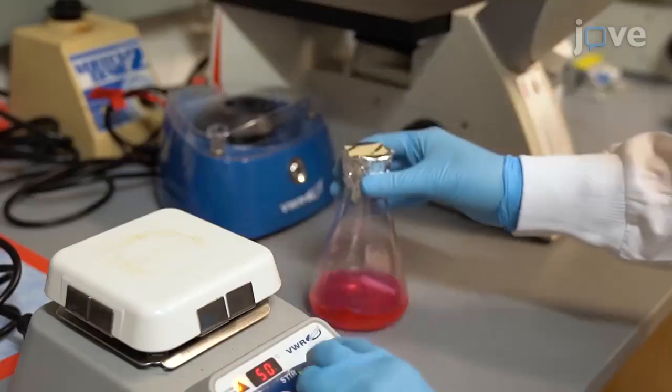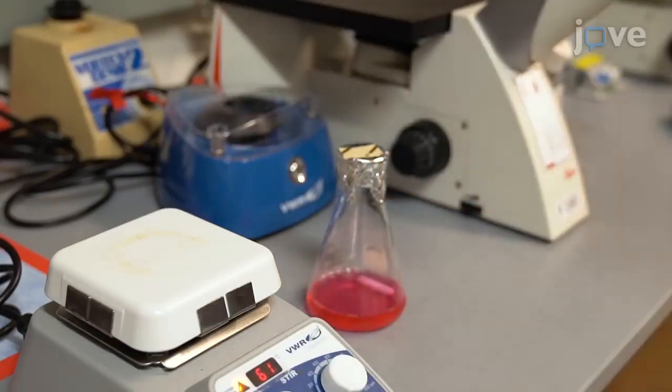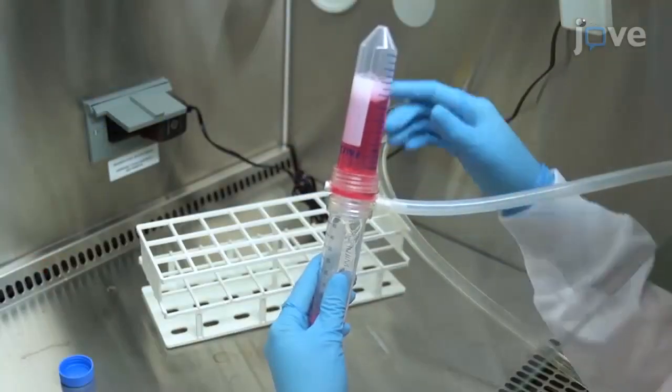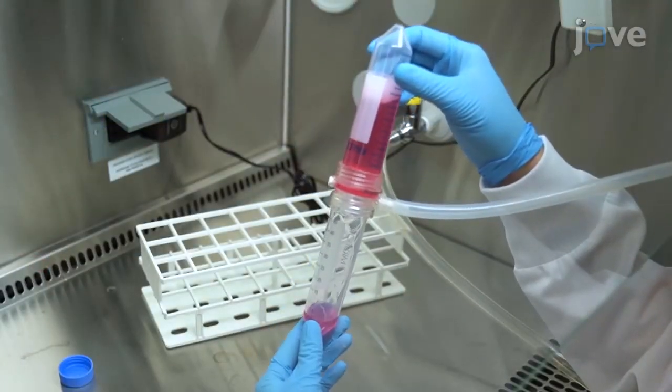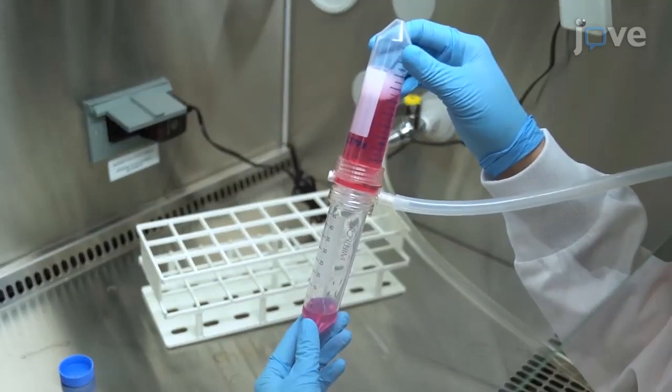After this, remove the PVA solution from the heating pad and allow it to cool down to room temperature. Once the solution is cooled, filter it through a sterile 0.2 micrometer filter.